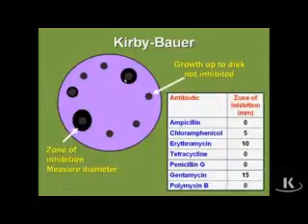Now, the additional discs, so you see one here, and these three over here, the organisms grew right up to the disc and were not inhibited by that disc at all. That means, in general, that they're considered resistant to that particular antibiotic. Now, what you have to be careful for is they can easily put this on the USMLE.